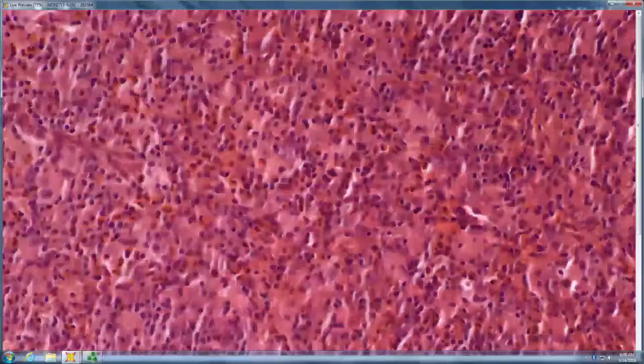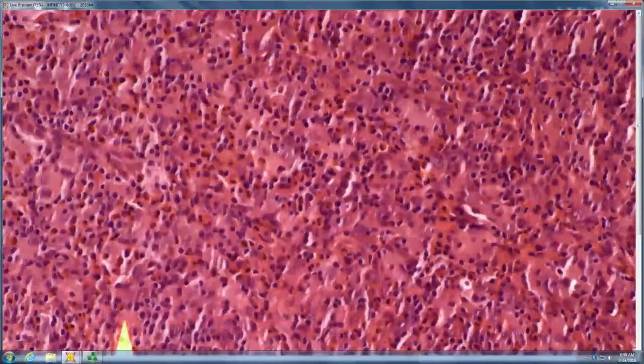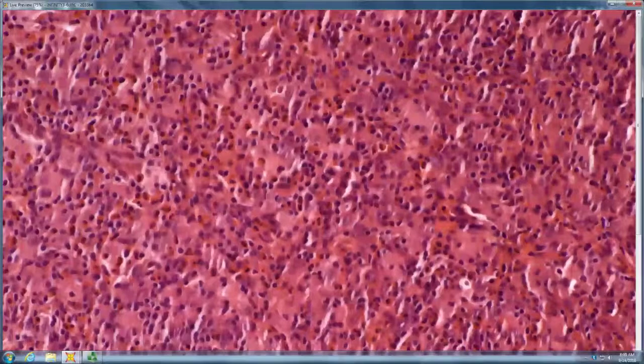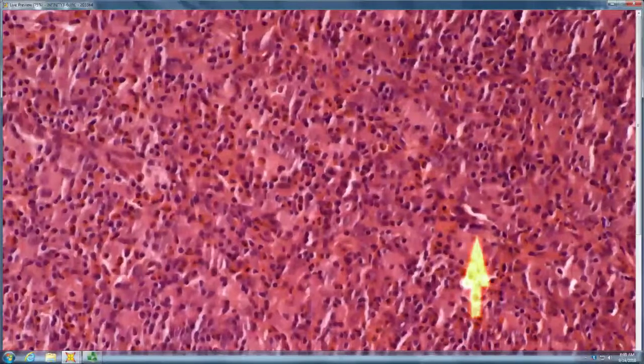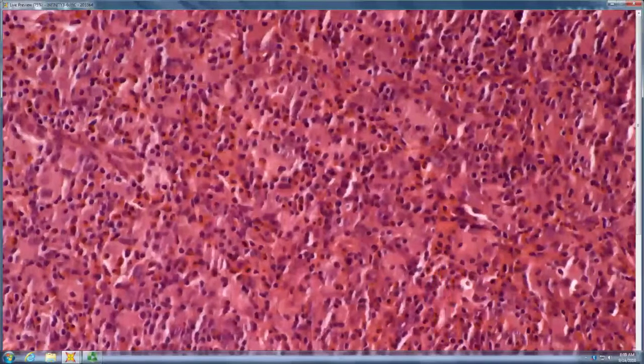You have a big nodule of pinkish cells. I'm thinking granular cells. It doesn't really look like that up close. Yeah, they're not granular. There are lots of eosinophils in here. But what are these background cells that form syncytial giant cells? There's like histiocytes. Yeah, probably histiocytic.